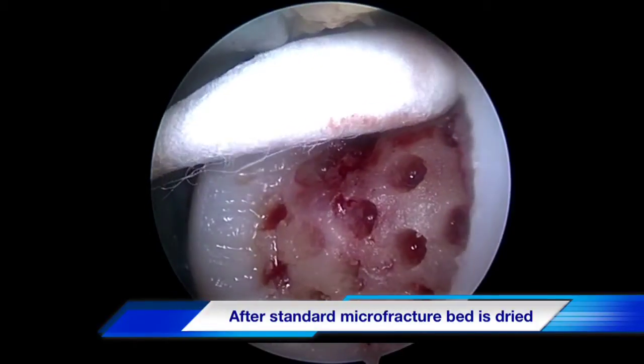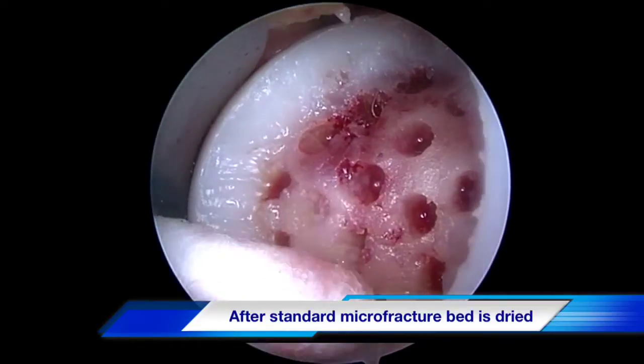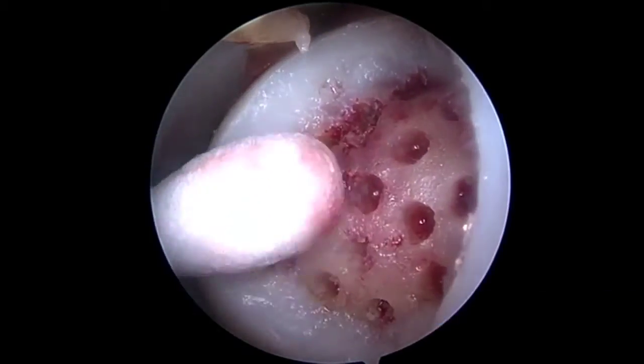The next step in biocartilage grafting is to dry the bed. We do this with a q-tip soaked with epinephrine and then prepare our graft replacement.